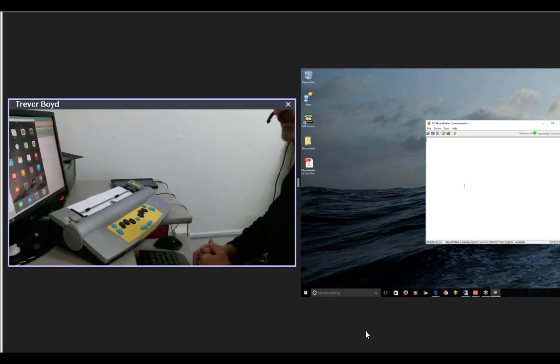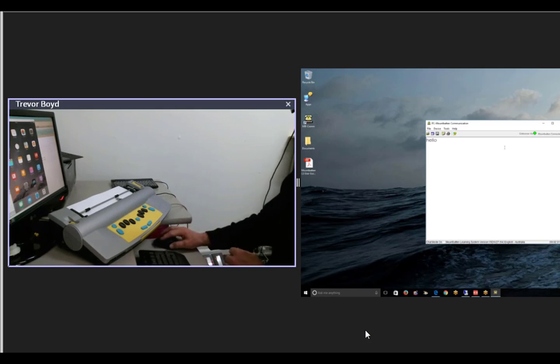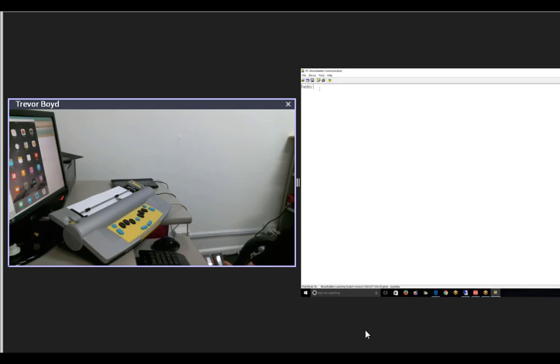I think the other thing I can do is chat mode. Chat mode is useful, and I can engage with a young student. What happens is that the text immediately comes up on the page as a student's brailing it. And so that gives me a one-to-one link so that I can know what's happening with the student as they're brailing, and I can watch this live. The drawback is that I've got to have my USB cable connected to a PC, which can be a bit of a drag.